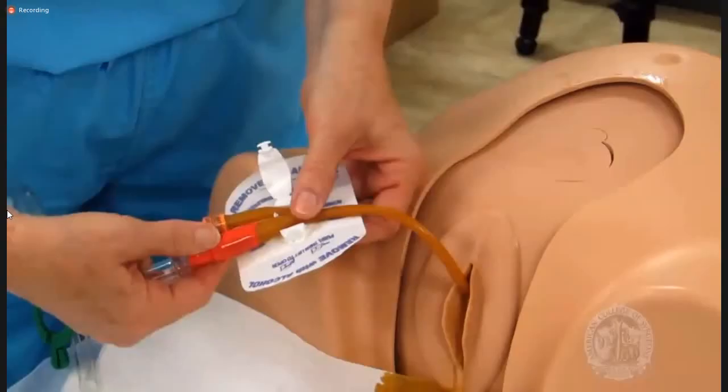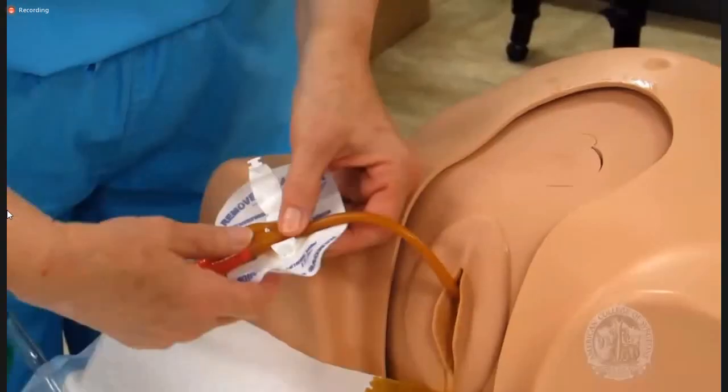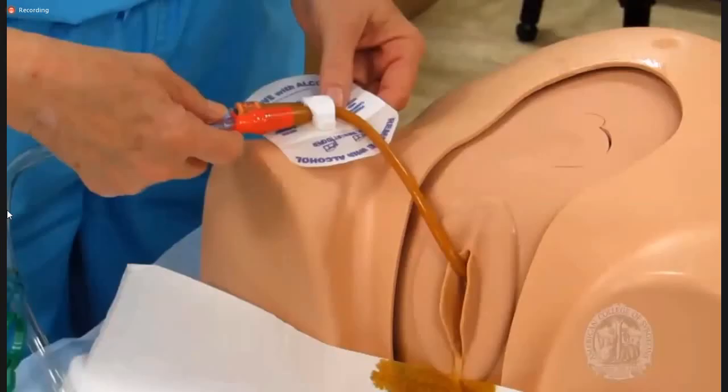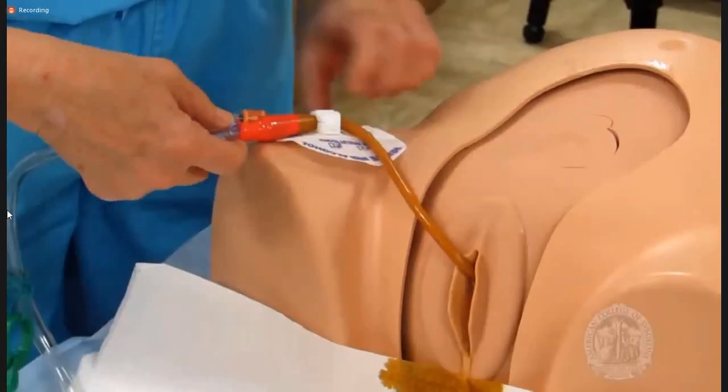Now it's time to secure the catheter. Many kits come with a stabilization device. Usually this device has a mechanism to lock the catheter in a single orientation and adhesive on the other side to secure it to the patient. So, like this.